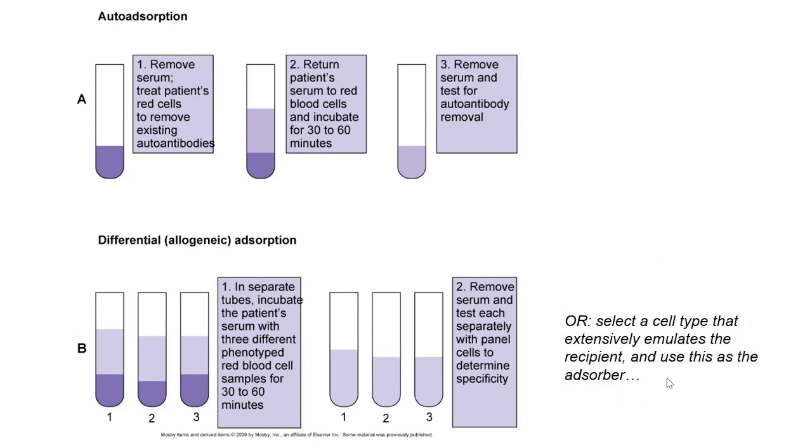It can be phenotype or genotype informed. So if you use that cell, it may be a good enough surrogate of your patient's red cell type. The extent to which it is a supermatched representation is the extent to which it can safely adsorb out nothing but the autos and give you an informative alloantibody discovering adsorbate.